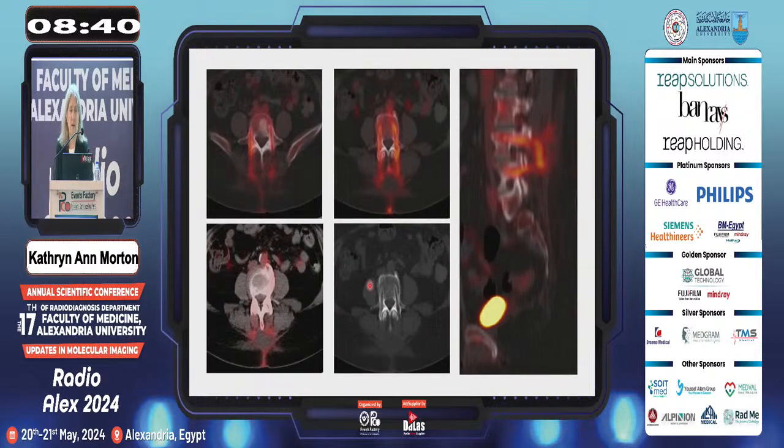This patient had an L4 or L5 posterior fixation rod. The skin over the rod was chronically reddened and occasionally draining. They went in and removed the hardware, and this was a scan that was performed approximately 3 weeks later, showing there was an abscess within the soft tissues, a fluid collection with uptake around it, as well as where these screws were within the vertebral body. They're all hot. There was infection going into all the skin tracts.